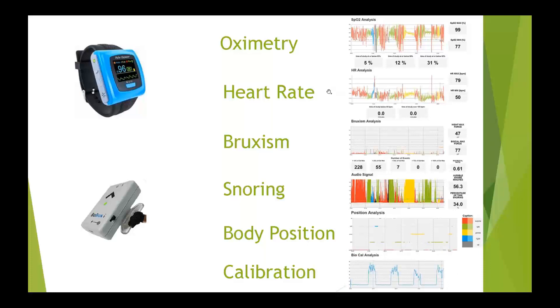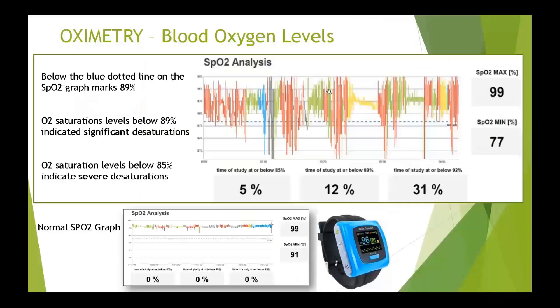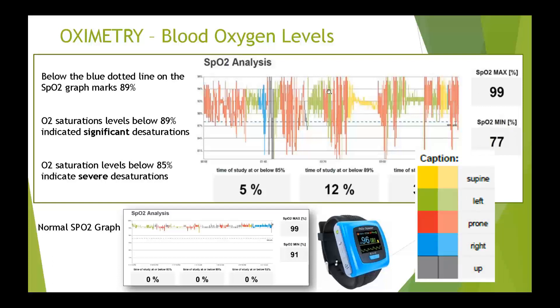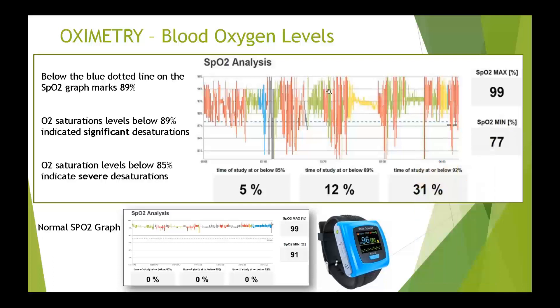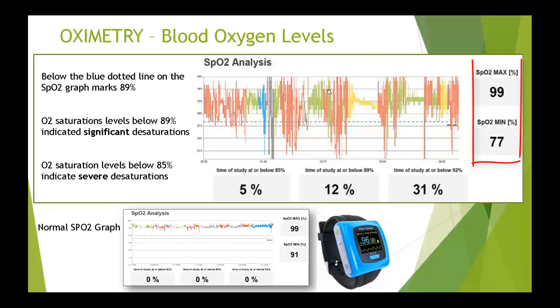The first graph is the SpO2 analysis — blood oxygen levels. The colors again indicate sleeping position. You'll also notice a dotted blue line drawn at 89%, meant to give you a sense of where the oxygen desaturations are. Around the graph, on the right side, you'll see a minimum and maximum SpO2 value — in this case 99% max and 77% minimum. Underneath the graph we have three bins.